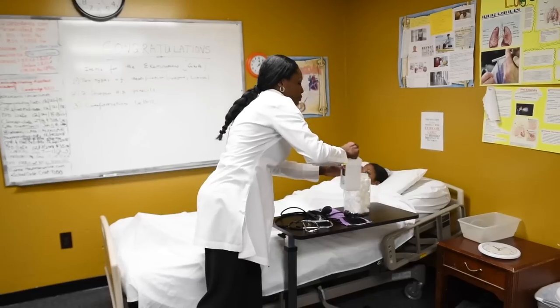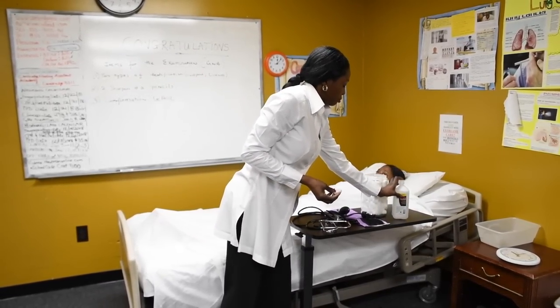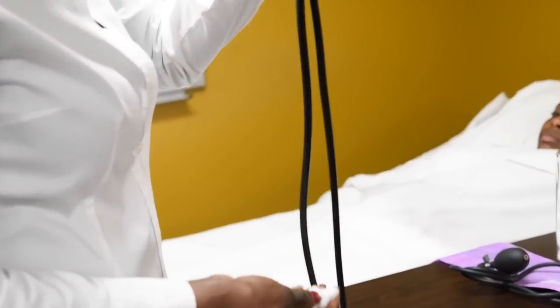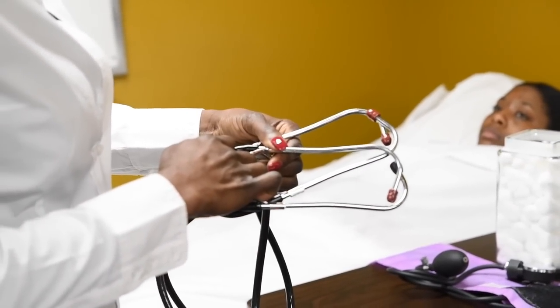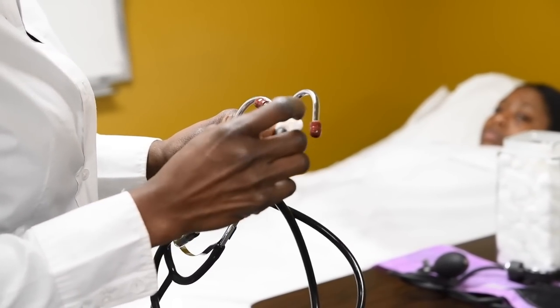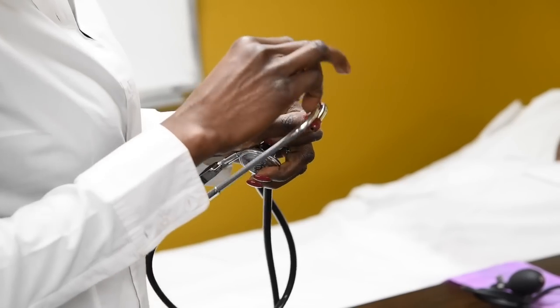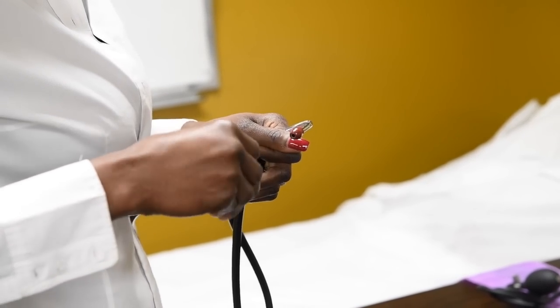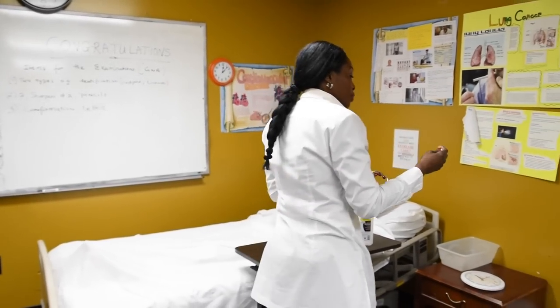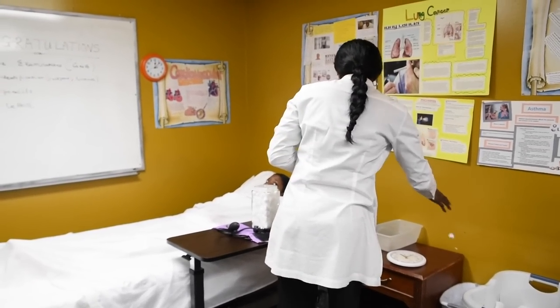Now I'm going to pretend I'm you. Like we said, you will not be speaking. You just come here. The examiner is up. You disinfect the diaphragm of your stethoscope. Then you disinfect the two ear pieces for you and the examiner, okay? When you get your alcohol, try your best not to soak the cotton ball with too much alcohol. If that's the case, then I would advise you to squeeze it out, or else your ears may start getting irritated.